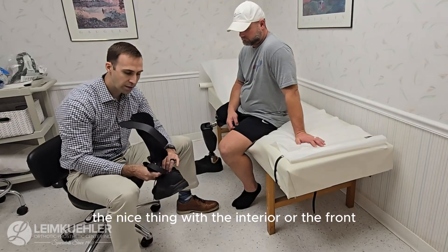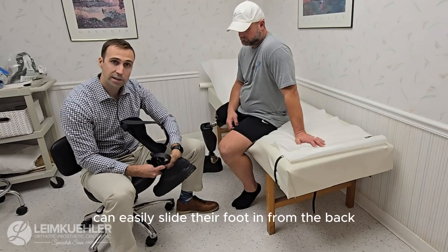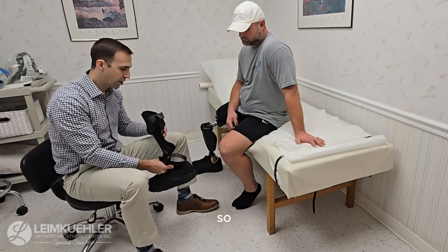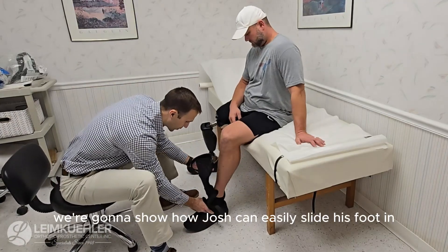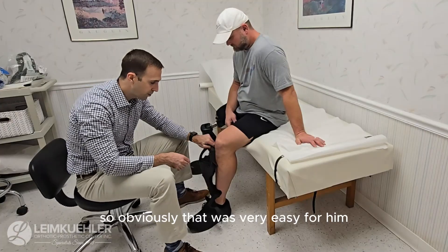As far as putting this on goes, the nice thing with the anterior or front design is the patient can easily slide their foot in from the back. We're going to show how Josh can easily slide his foot in — and obviously that was very easy for him.